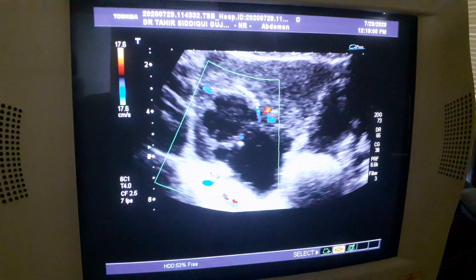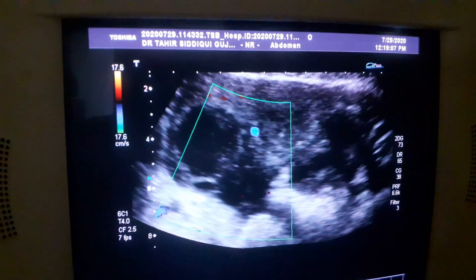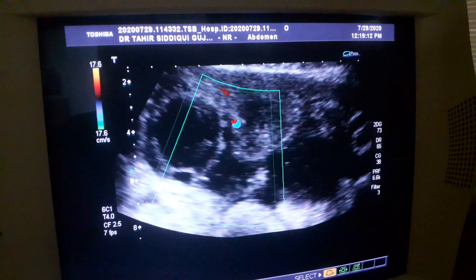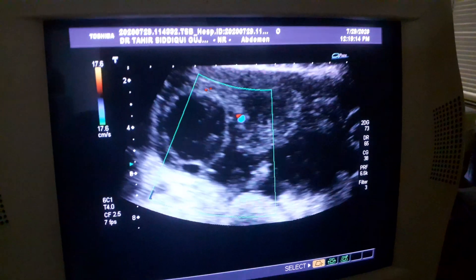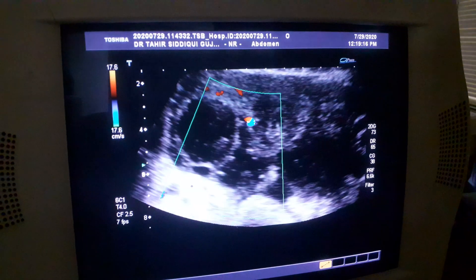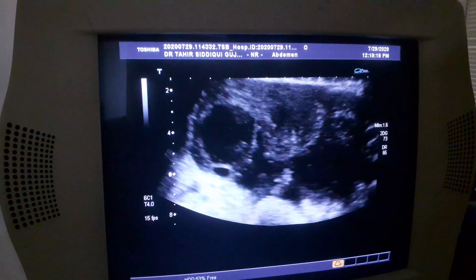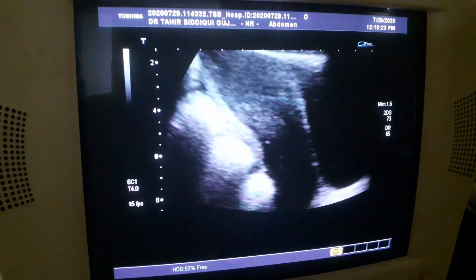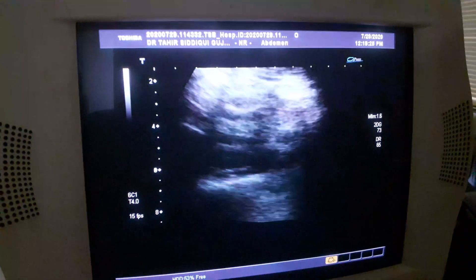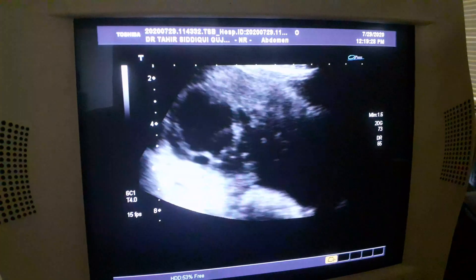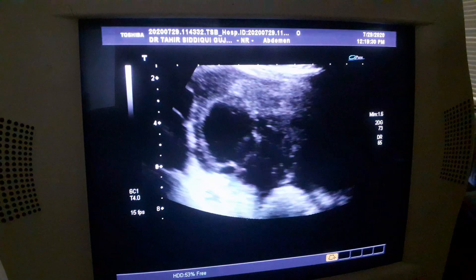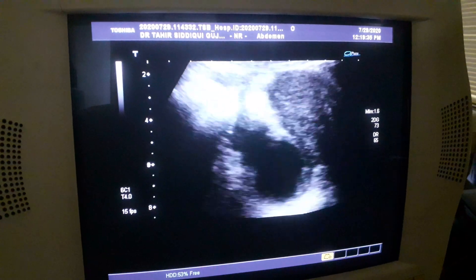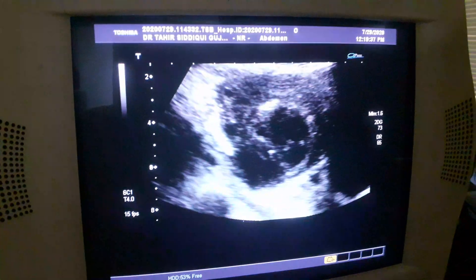On the right side also you will see a small amount of fluid. So this is the case of the day, which is bilateral tubo-ovarian cystic masses of infective nature with pelvic inflammatory disease suggested by fluid in the pelvic cavity. The size of the uterus is normal and there is no other pathology seen. Thank you very much.